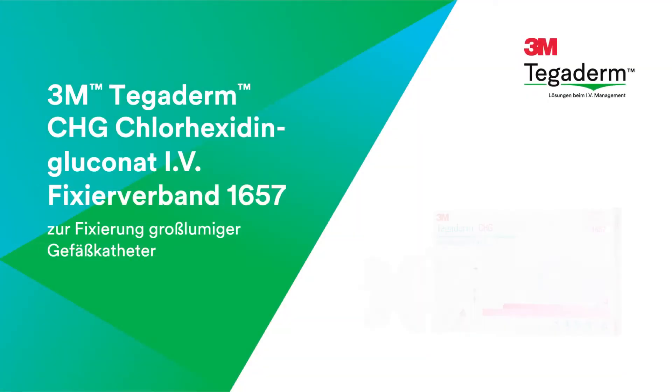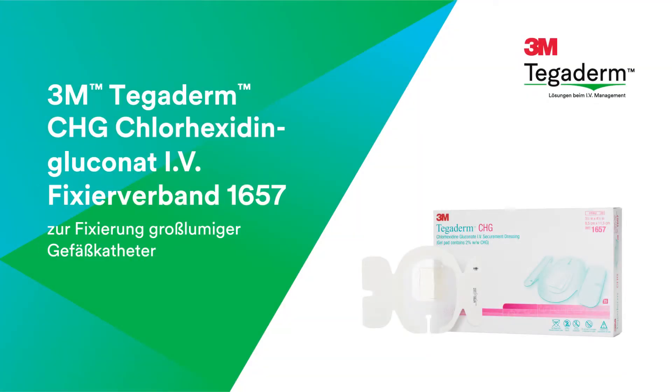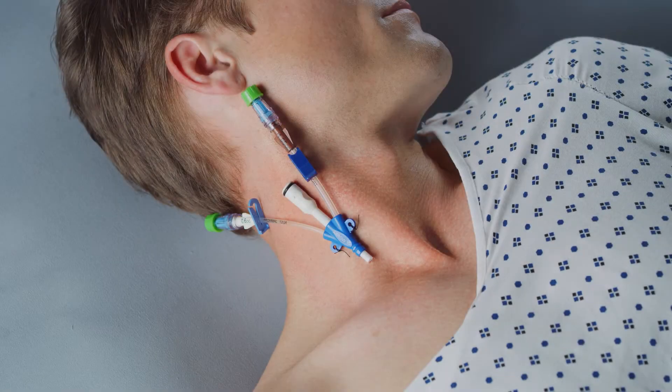In this video, you will learn how to apply and remove 3M Tegaderm CHG Chlorhexidine Gluconate IV Securement Dressing 1657 on a multi-lumen introducer inserted in the internal jugular.